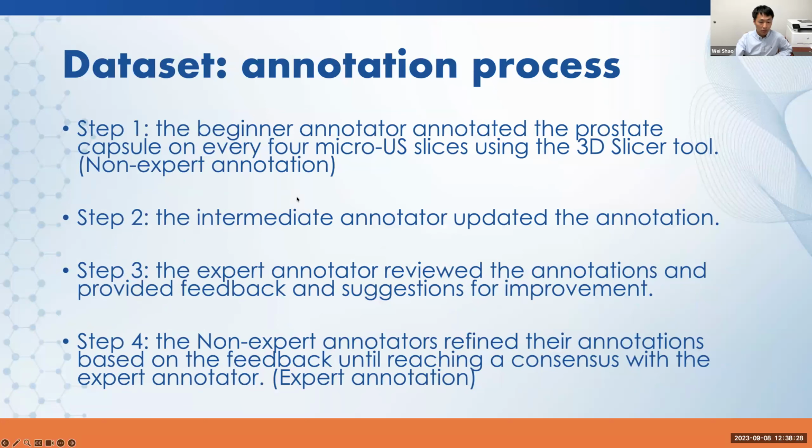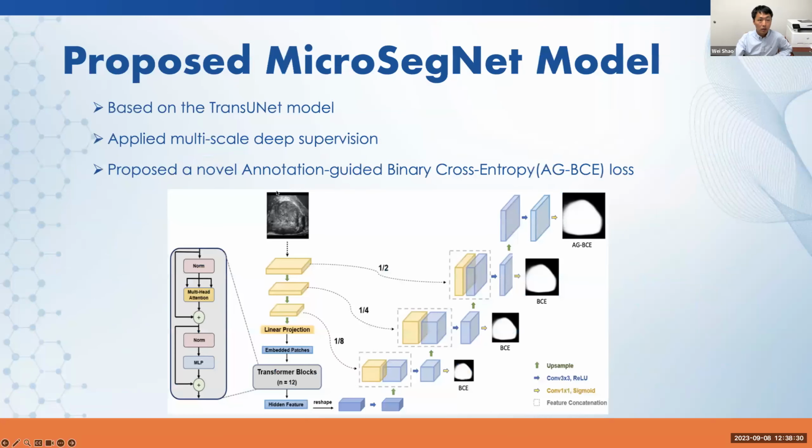The proposed segmentation approach takes advantage of this unique dataset, which consists of expert annotations and non-expert annotations.